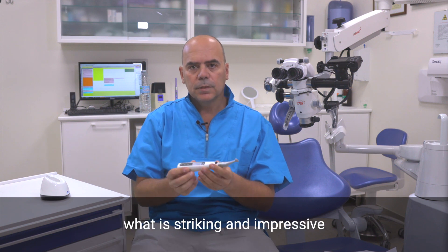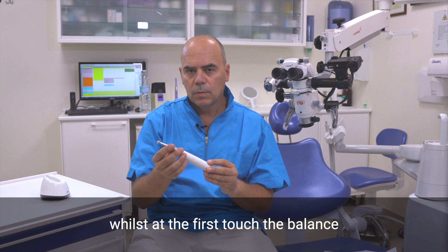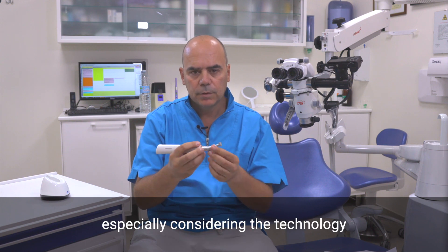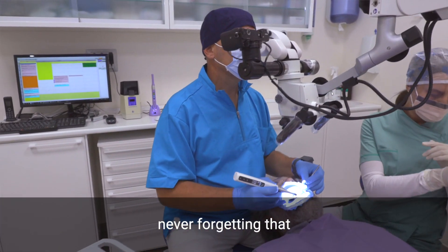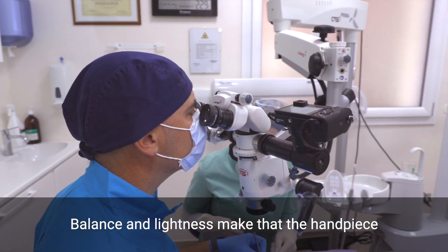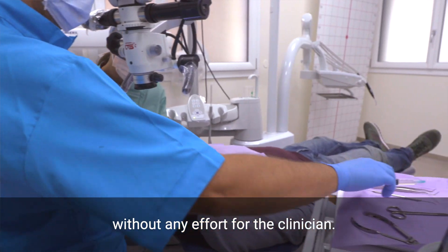At first glance, what is striking and impressive is the amazing design, while at the first touch the balance and the lightness are really surprising, especially considering the technology inside the end piece. Never forget that even the Apex Locator is integrated. Balance and lightness make the end piece stay steady in your hand without any effort for the clinician.